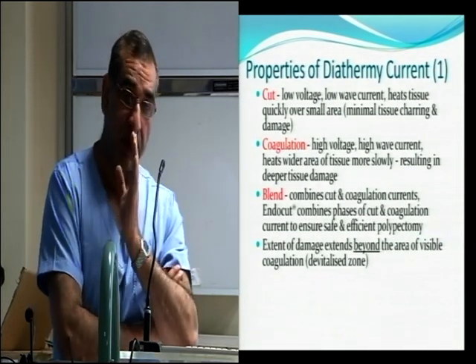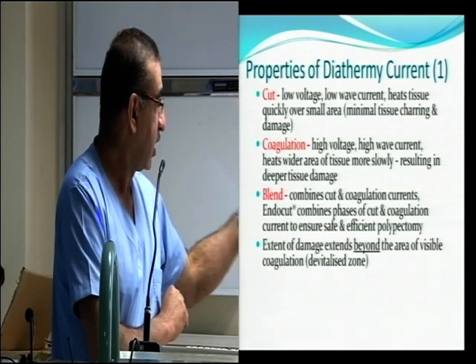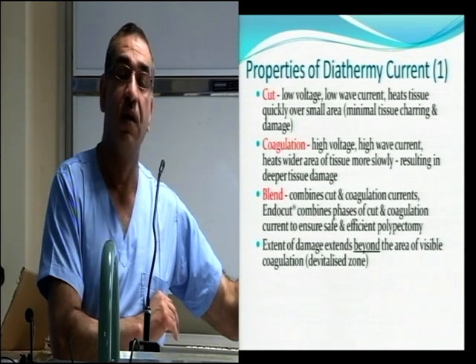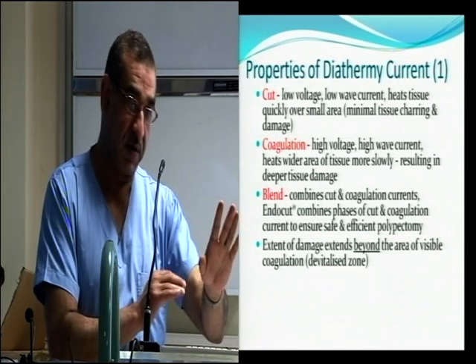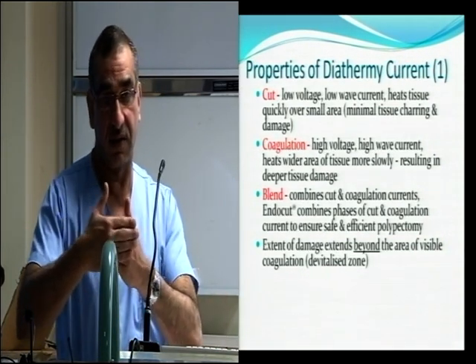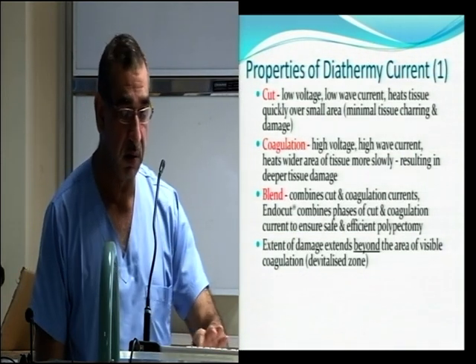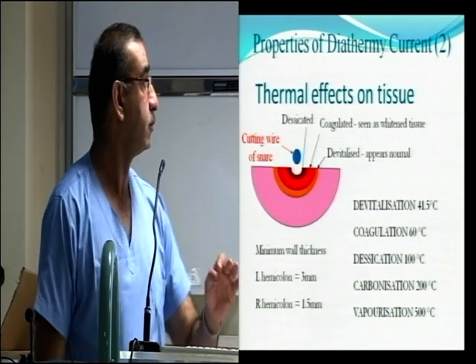One of the most important things to remember is that the extent of damage extends beyond the area of visibility. You might see that it looks like you've done a good job, but the damage goes deeper. So that is something which we have to be very cautious about.